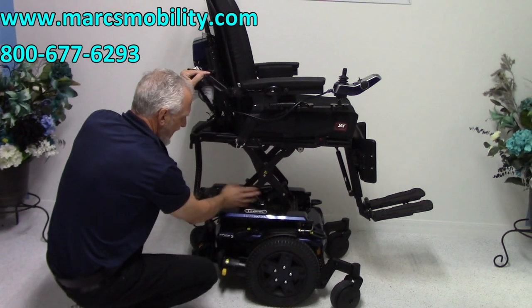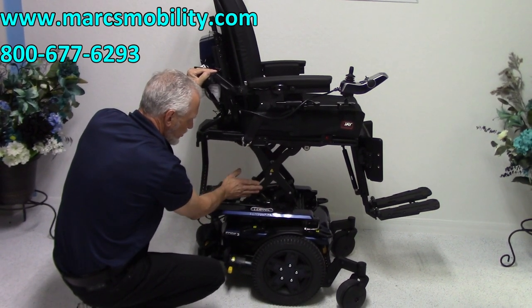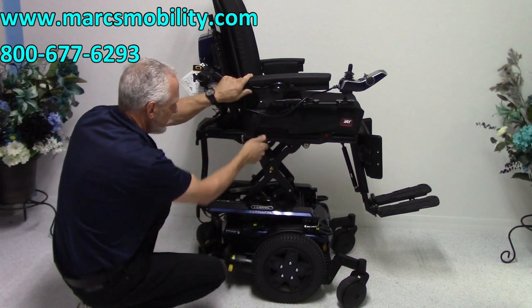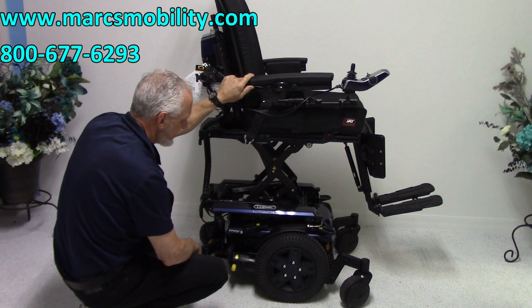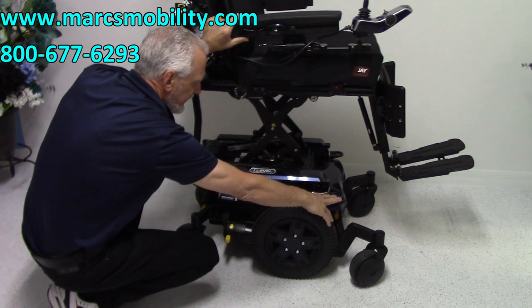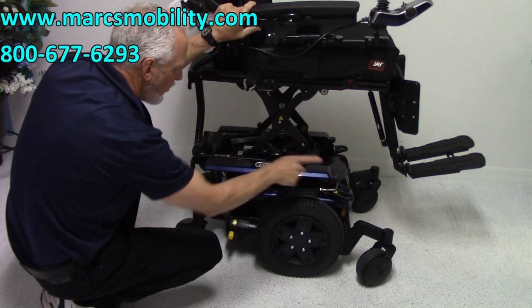You can see the actual actuator right here for the seat lift. You can see how well the armature is — it's a four-point seat lift, very straight, very solid, keeping the chair solid. We've got anchor points here to tie your chair to your lift and to your van. There's two on each side, for a total of four anchor points.